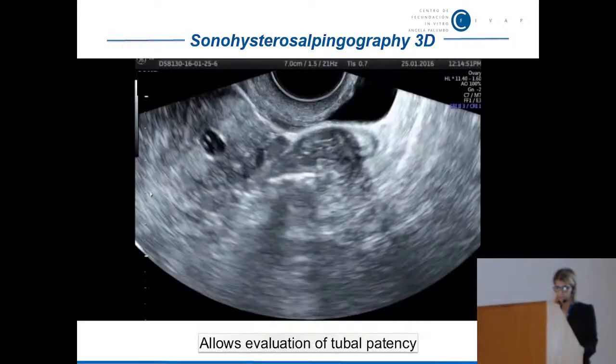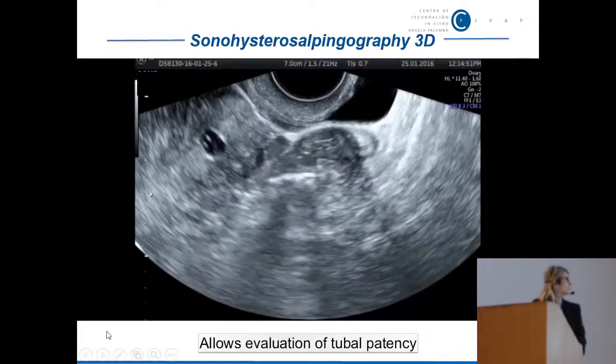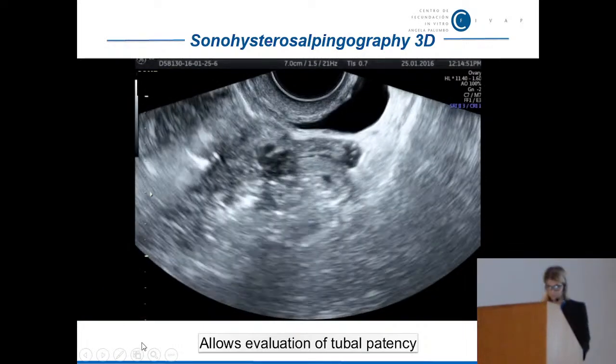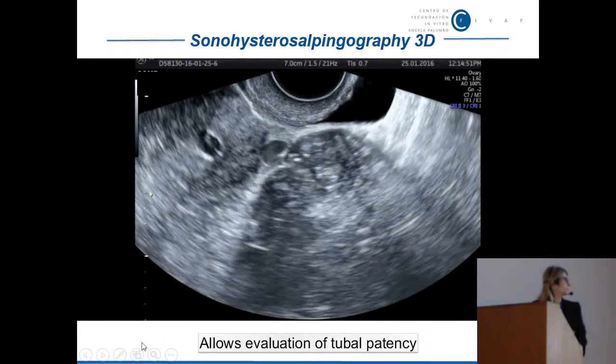In this video, you see that the tube is patent and air is coming out of the fimbria.